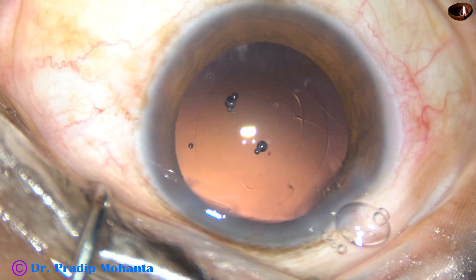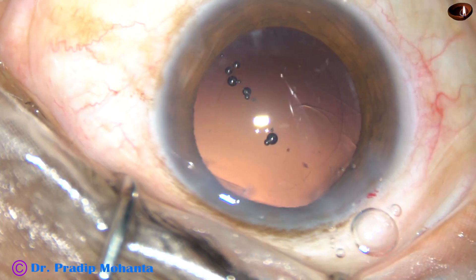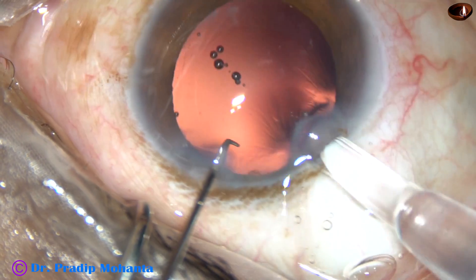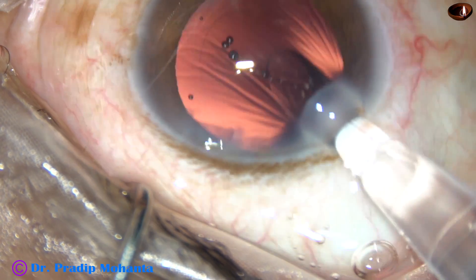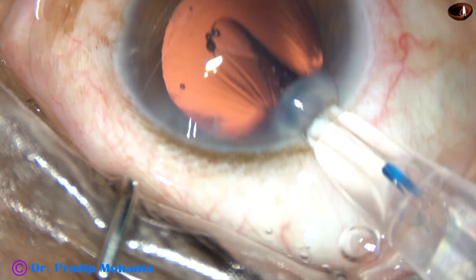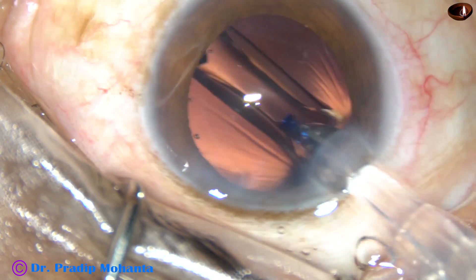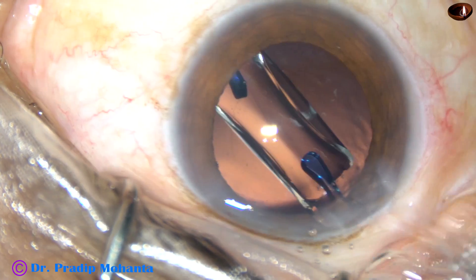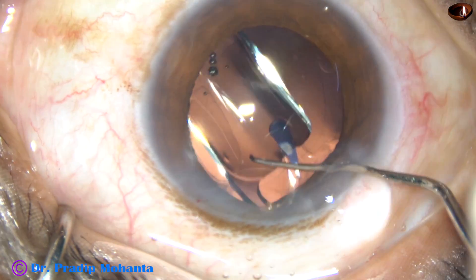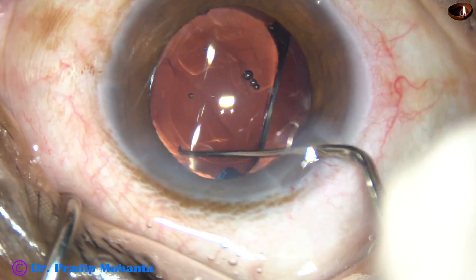Inject viscoelastic substance, inflate the capsular bag, fill up the anterior chamber, and now implant the intraocular lens. This is a Hoya non-aspheric single-piece monofocal intraocular lens. Here goes the lens into the capsular bag — the leading haptic has gone into the capsular bag and the trailing haptic has been pushed into the capsular bag.